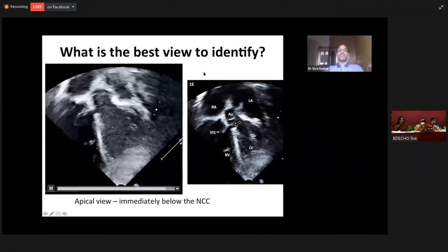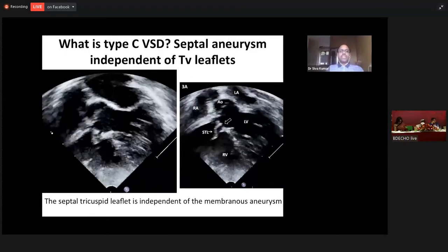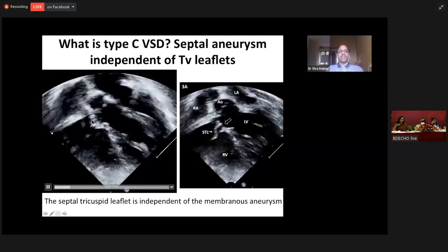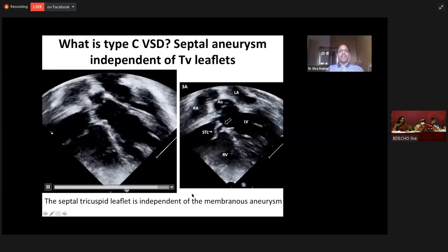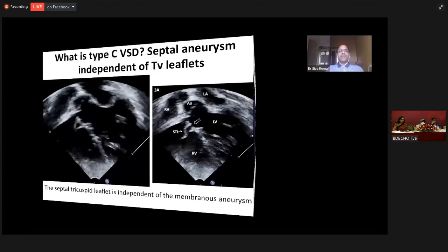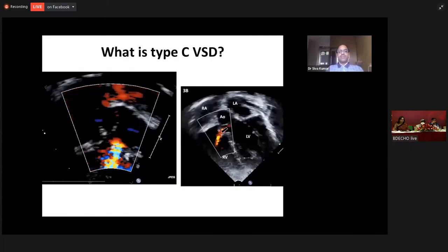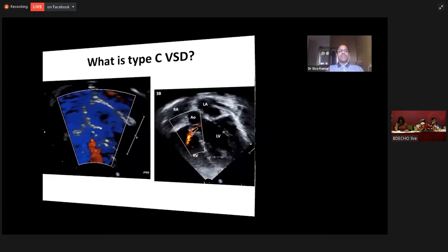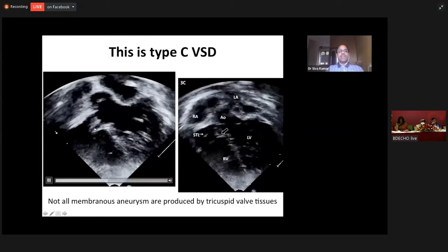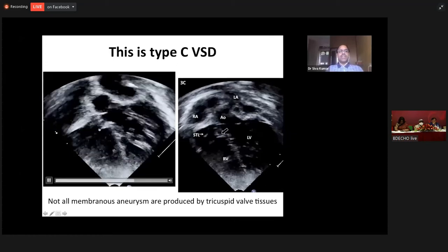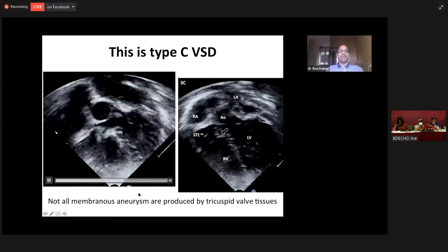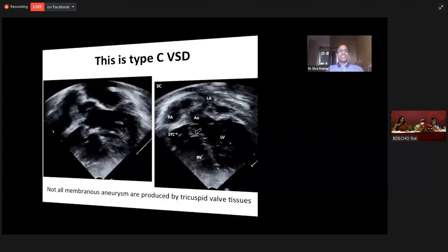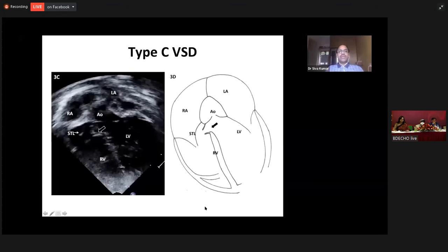That is independent of the tricuspid valve leaflets. We can appreciate the septal aneurysm here, but it is not contributed by the septal tricuspid leaflet. On an apical four-chamber color view, we can see the color flow through the perimembranous VSD. When we carefully observe this septal aneurysm and the septal tricuspid leaflet, we can appreciate that they are independent of each other. The septal leaflet is not forming this aneurysm — it is formed by in-growth of tissue from the edges of the VSD. Such a VSD is called a type C VSD.